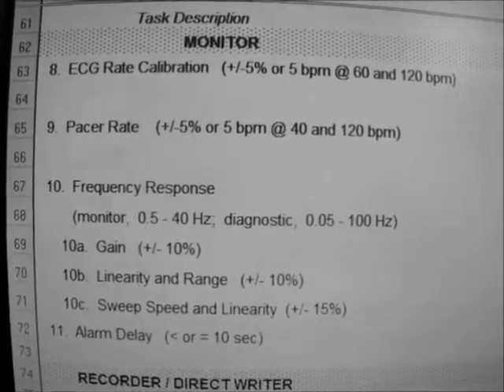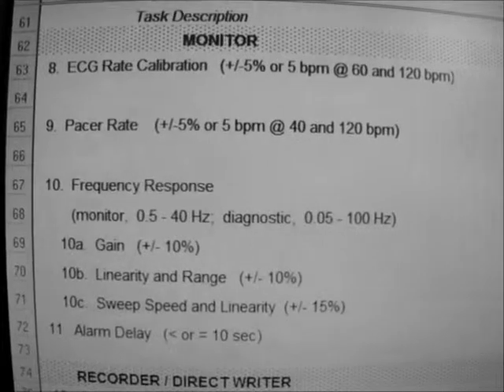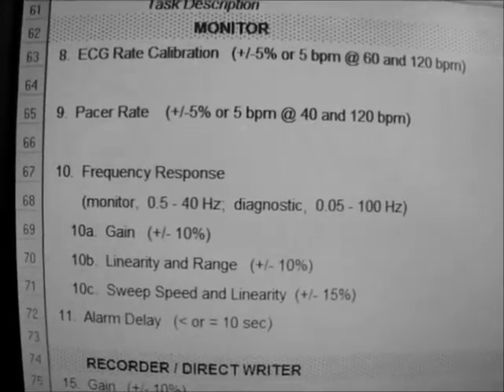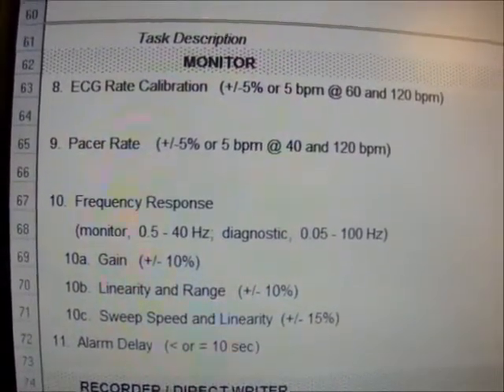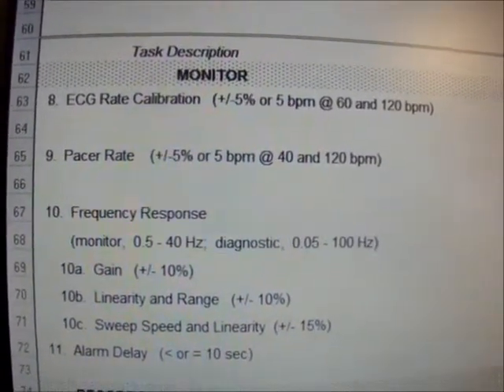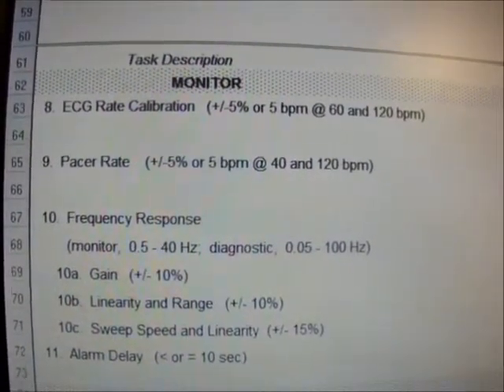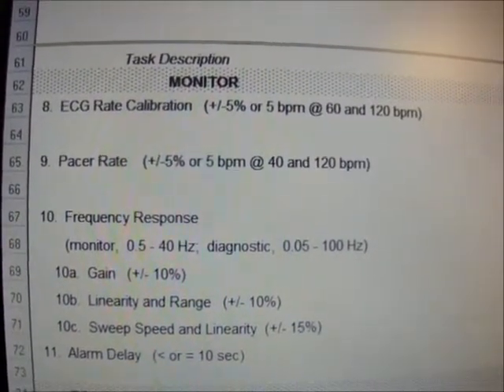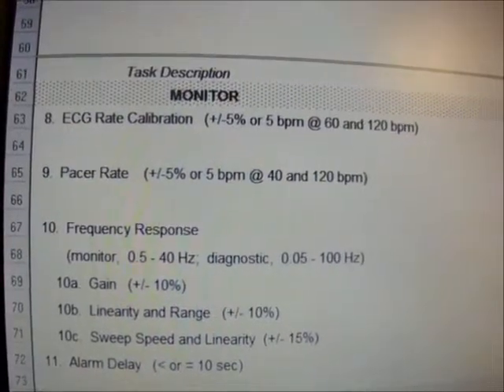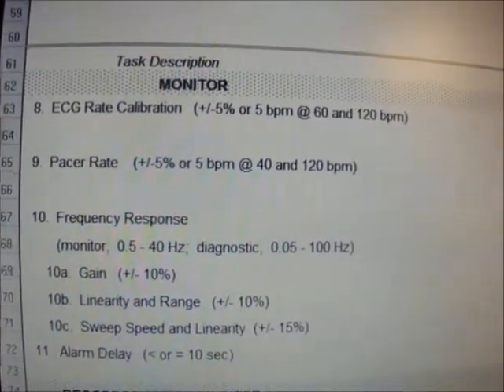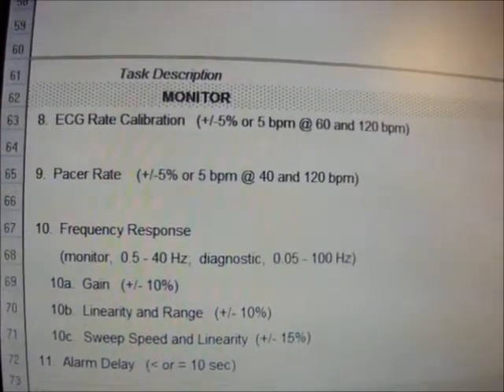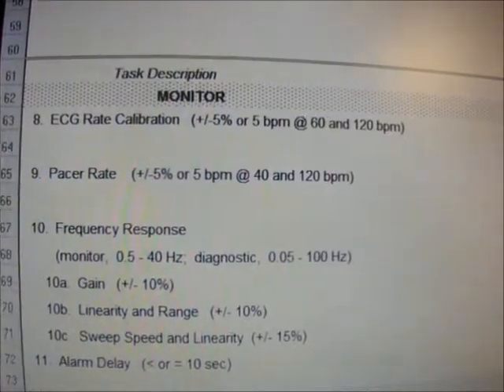ECG rate calibration measures the ECG performance of a simulated patient at both 60 and 120 beats per minute, plus or minus 5% beats per minute. Next, pacer rate — the pacer output can be measured using an oscilloscope set to DC-coupled, connected across a 100 ohm 5-watt load resistor. The pacer output is a positive-going pulse 40 plus or minus 2 milliseconds duration, with an amplitude of 0.1 volt per milliamp of selected output. For example, 40 milliamps of selected output has an amplitude of 4 plus or minus 0.5 volts. If an external non-invasive pacer analyzer is used, follow the manufacturer's guidelines for measuring frequencies and output.